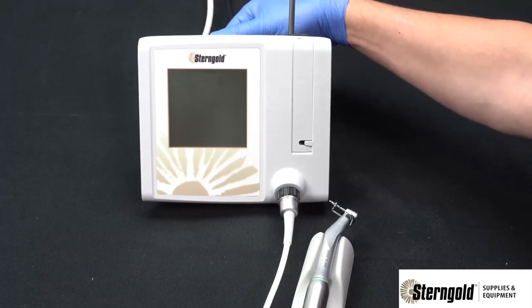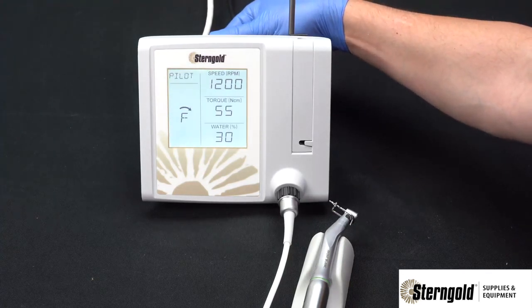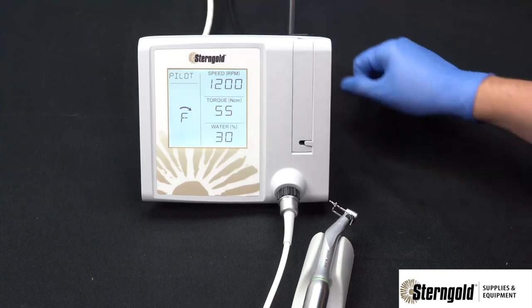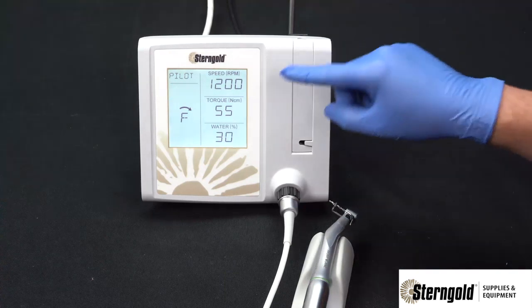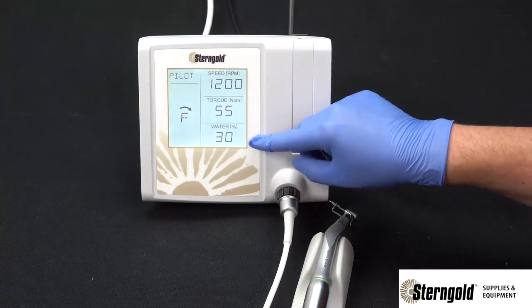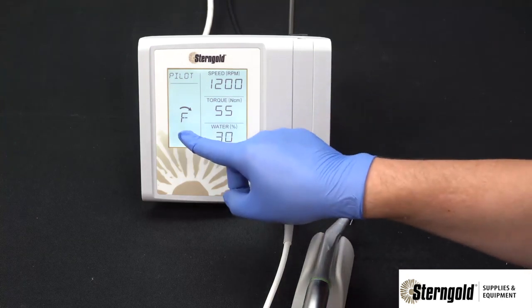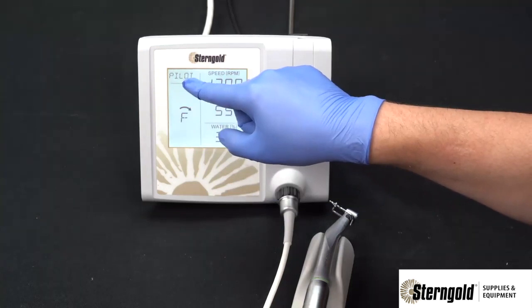When the console is powered on, the unit will self-calibrate, show a software version, and go to the operating screen. The operating screen consists of five essential parts: speed, torque, water flow, forward and reverse, and preset selection.